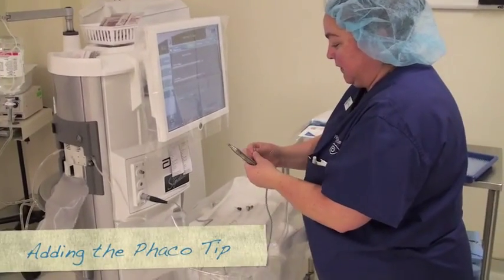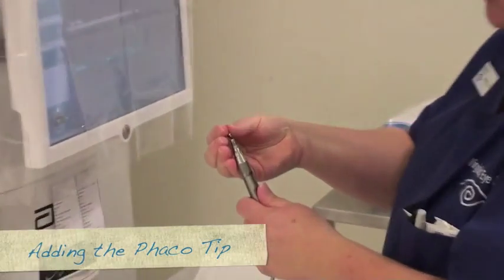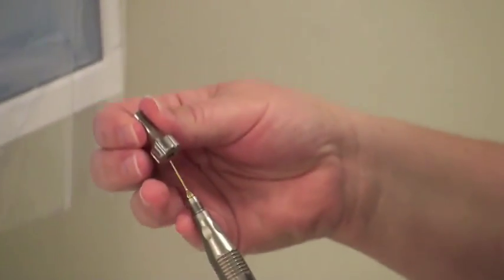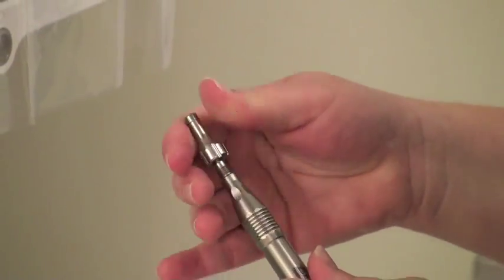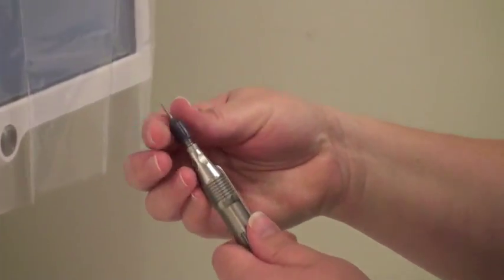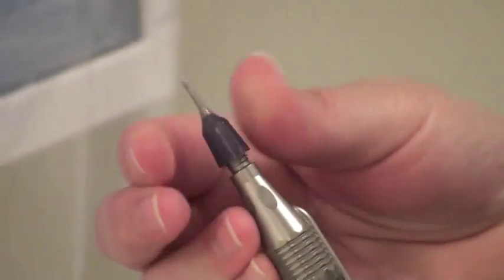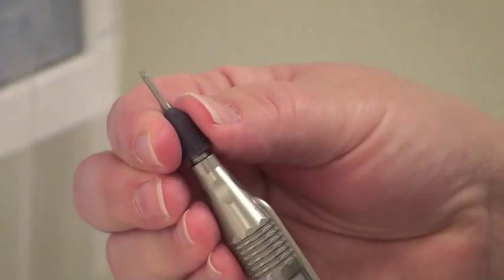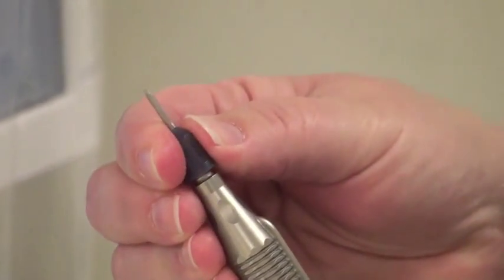Then you need to put a phaco tip on it, which is this little gold piece, and it just screws into the top. You screw it in, and then you'll have a little item that looks like that. It's a little wrench — you put that on top and tighten it once and then twice, just to make sure it's nice and tight. Then you're going to take your purple sleeve and put it on top of the tip, and just screw it down until the gold tip just sticks up the edge of the purple sleeve.